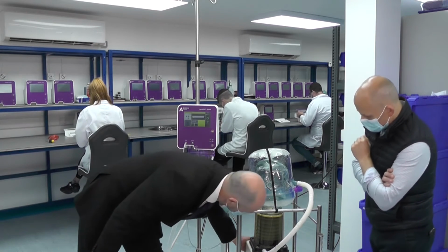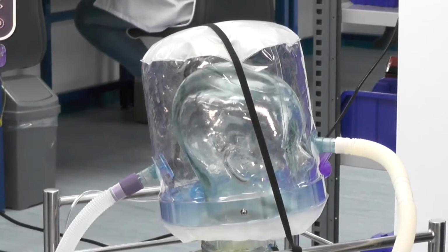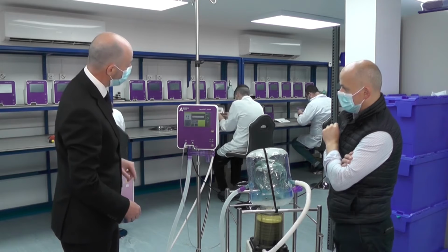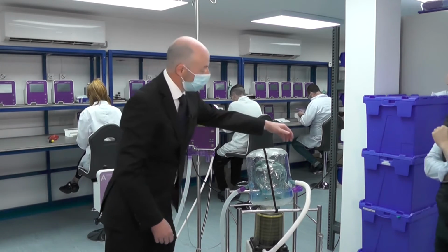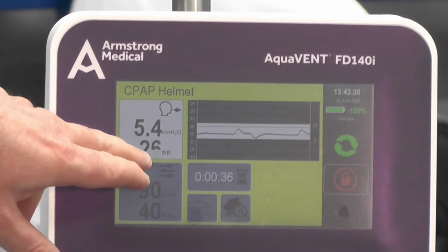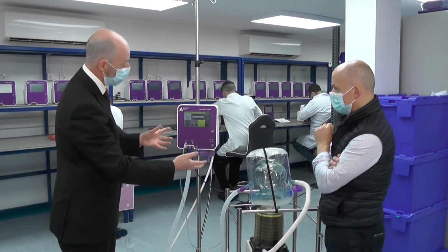So in our system here, with our artificial respiration, we can see that the respirations are beginning to show via the pressure trace on the screen. The CPAP, which we're intending, is 5 centimeters of water pressure. That's set with a fixed PEEP valve. And it's generally doing what it's meant to do in the simulation. It's recording 25 breaths per minute, and that'll stabilize after some time with the simulation rig.